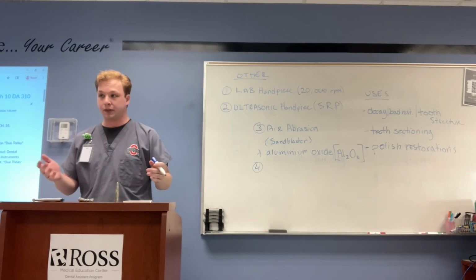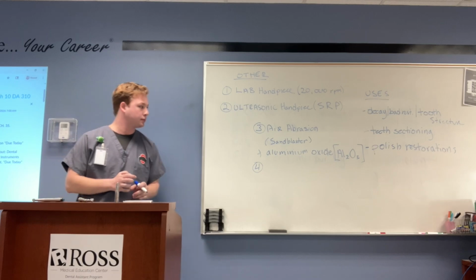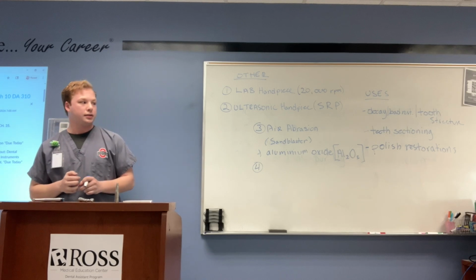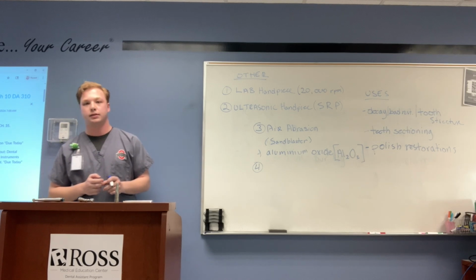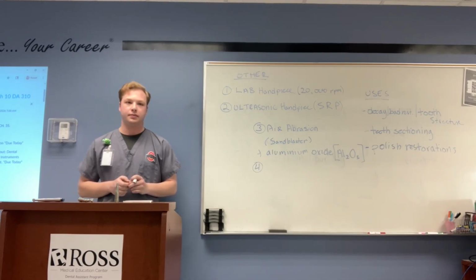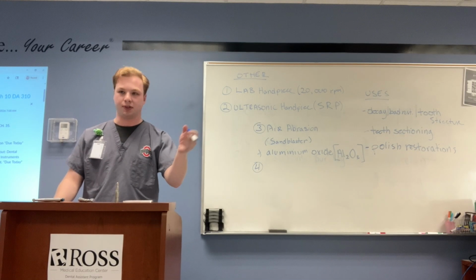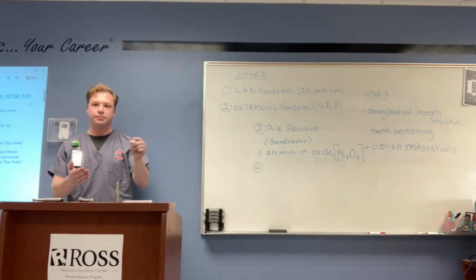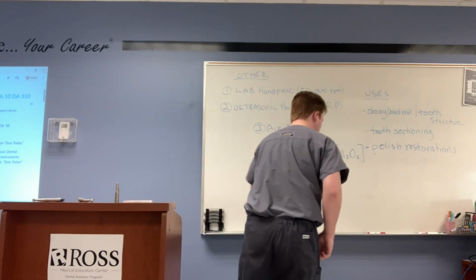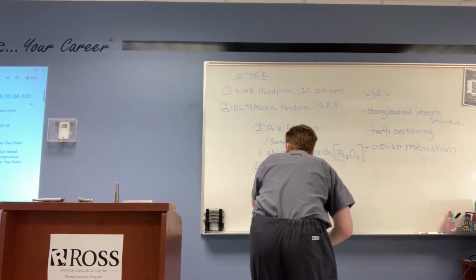So you'll clean your crowns out with it, and if somebody comes in and has cement in the crown, you'll clean the cement out, or stuff like that, is basically what we've used it for. We don't really use it for much else, except when it comes to crowns. Everywhere I've worked that has it, it's just crown stuff. You have to be careful, because doctors will tell you, if you're dealing with a certain type of crown material, what to take off of it.